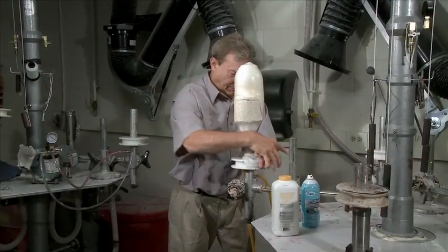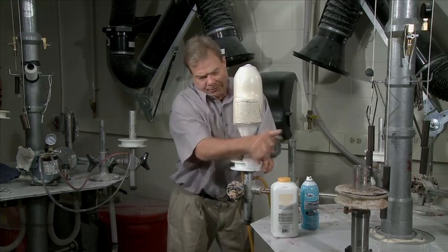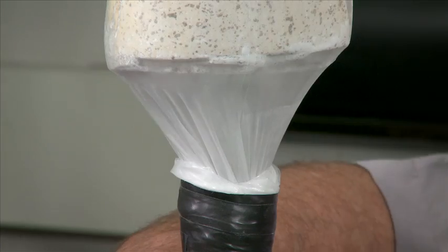Smooth out any remaining imperfections. Tape, and let the bag rest for a minute or two — this draws the bag in even tighter. Finally, apply vacuum for an exact fit.